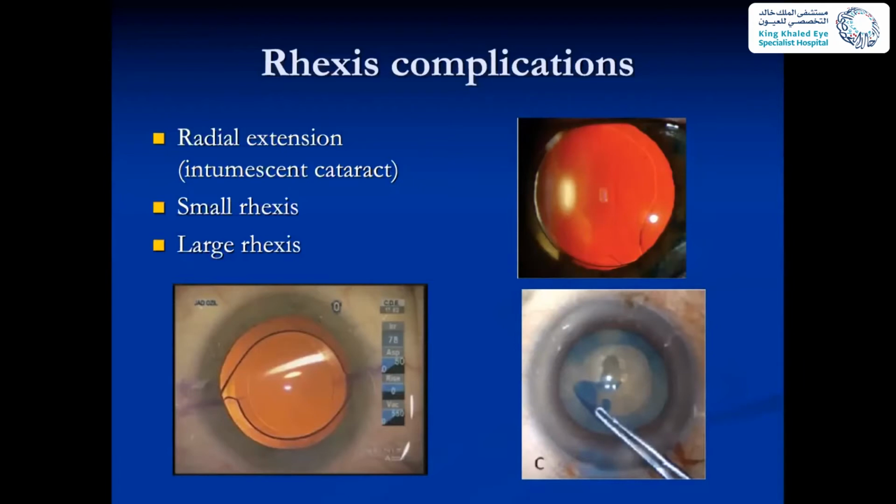So if we feel the rhexis is getting out or trying to escape, we just stop and inject viscoelastic to substitute whatever viscoelastic might have escaped during our first half of the rhexis. Then we have good pressure in the anterior chamber, and we hold the capsule and direct our tension or pulling toward the center of the eye. This usually corrects the movement of the rhexis.